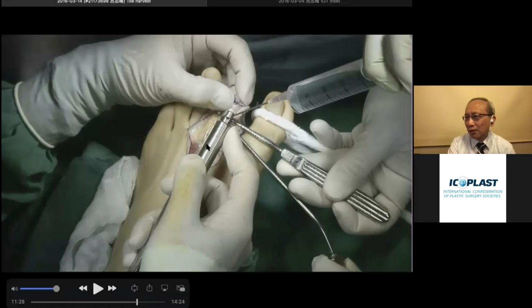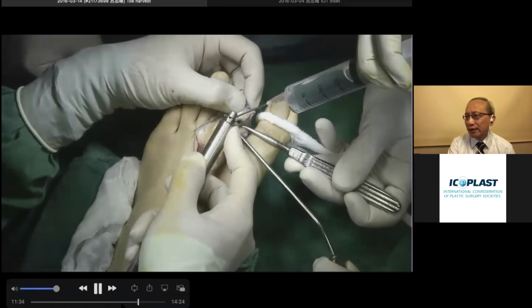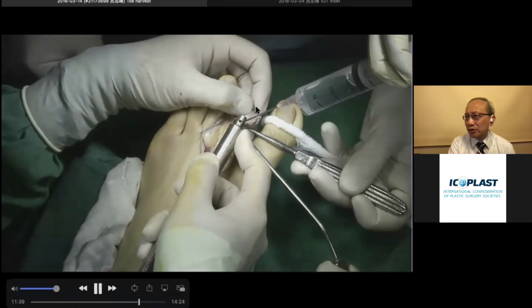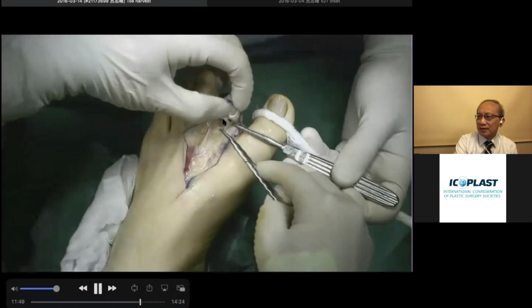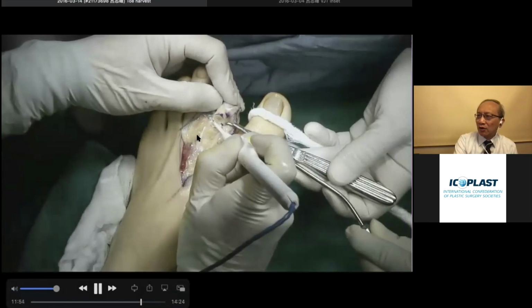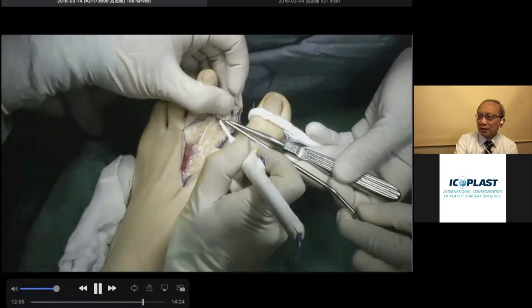Sometimes it will fool you, for some cases the toe was deviated before the transfer. But you just try to make sure that your osteotomy is parallel to your PIP joint. Okay, so we do the osteotomy vertically. Hopefully we can do a very parallel osteotomy that makes the inset faster, so you don't have to adjust the inset, the osteosynthesis. If you cut it a little bit oblique or too much at the dorsum, or sometimes on the tibia side or on the fibula side, then you have to correct the deviation when you do the inset.